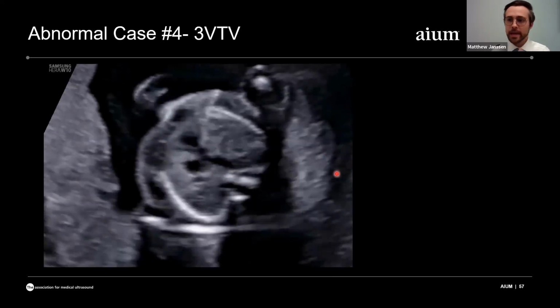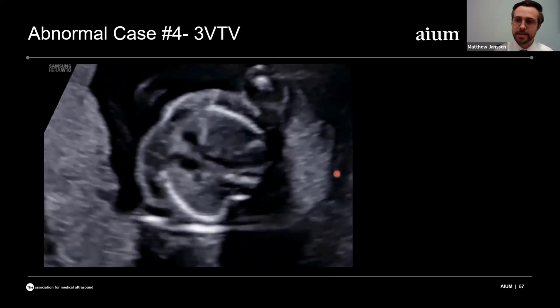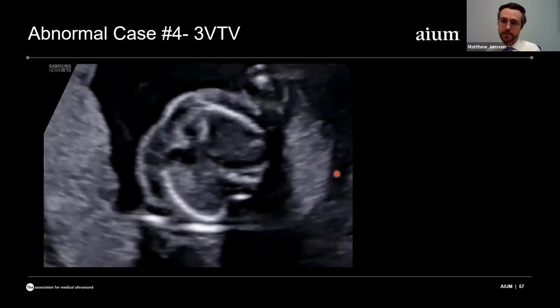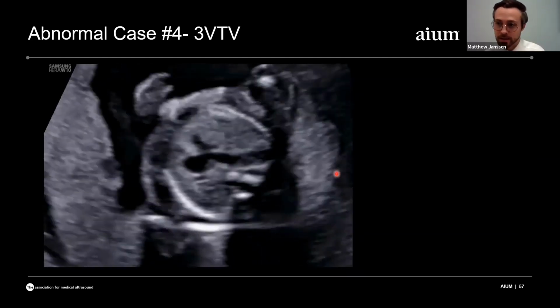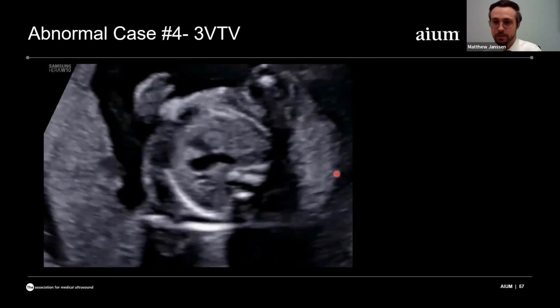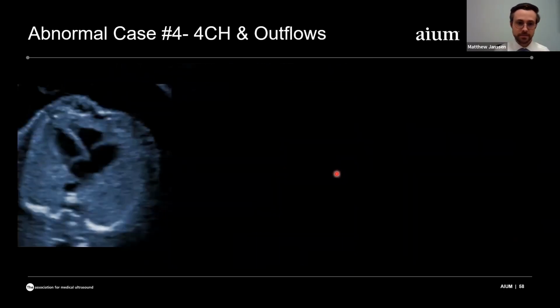That being said, we can't be sure at this point if the aorta is actually what's abnormally dilated, or whether the pulmonary system is smaller or more stenotic than we would expect. And we can't quite tell that from just the views that we've presented so far. We have to go investigating still. And so we go investigating, we look at the four-chamber, and that looks relatively normal.